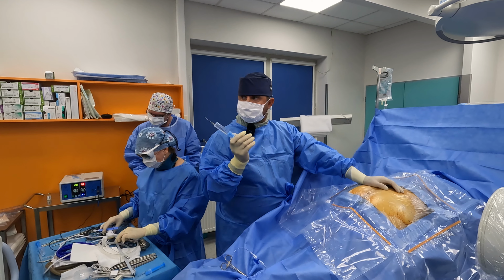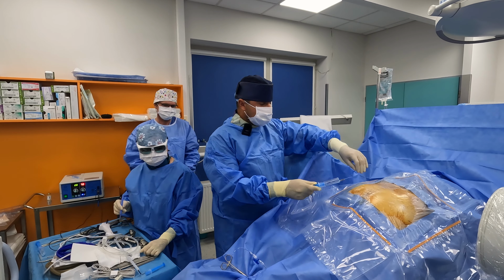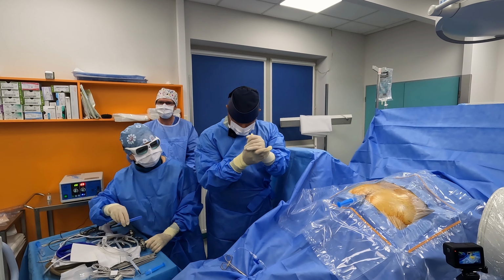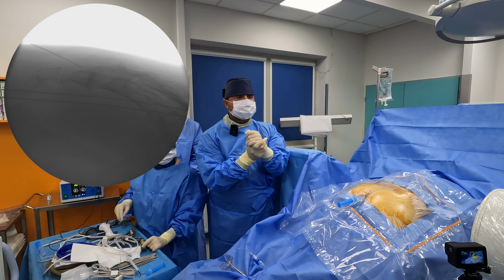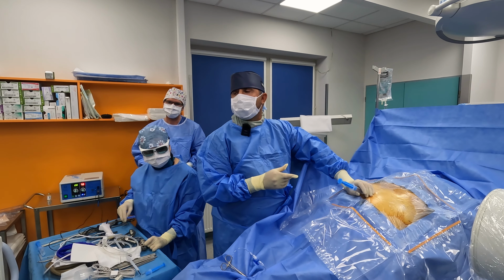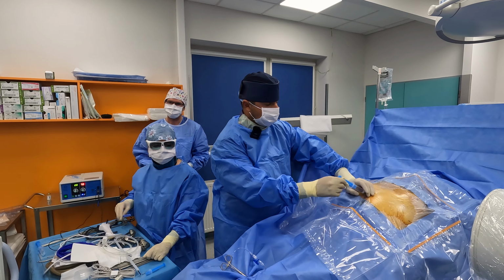hiatus. You do it in lateral projection on your C-arm, and everything is going under C-arm control. So the first step is you're going with your needle to the sacral hiatus, checking where you are, and then you're trying to achieve an angle which is no more than 45 degrees, just because your target is the anterior epidural space.